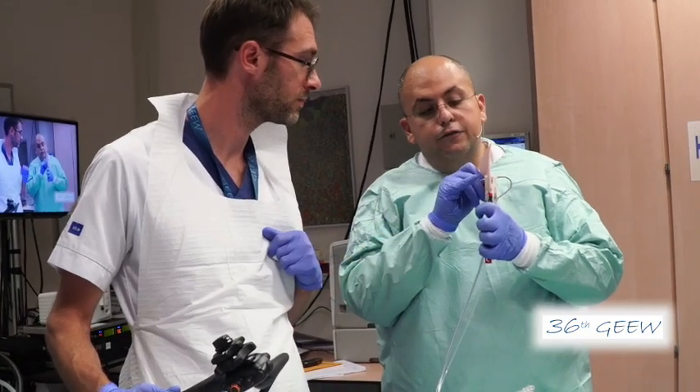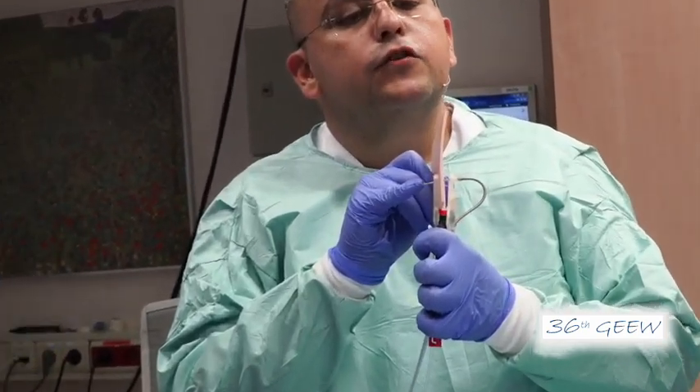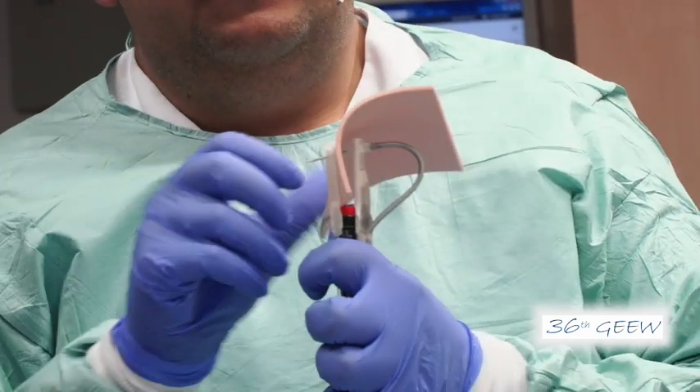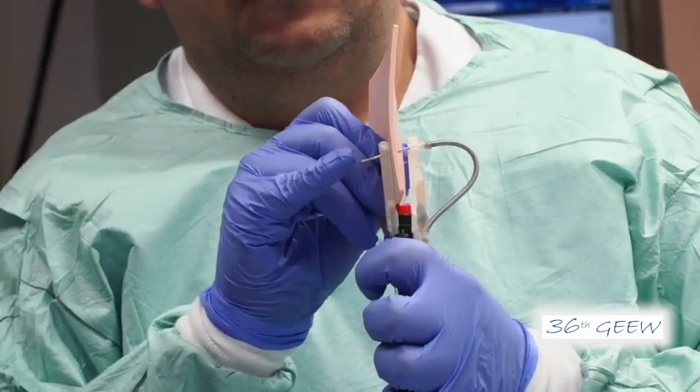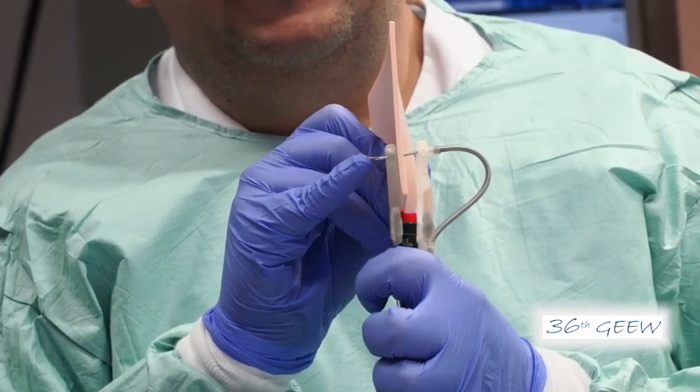You can see now the first tag here — you can release it. You can see here this white tag, which will be released now.